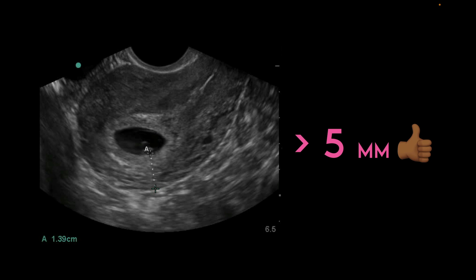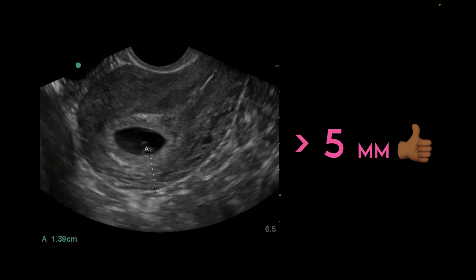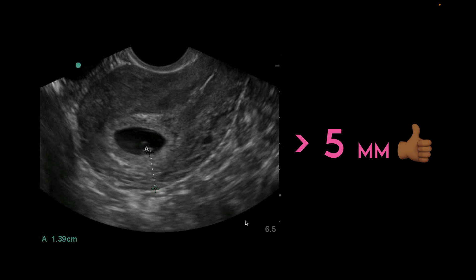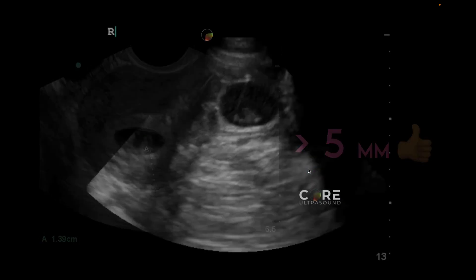To identify a fundal pregnancy that is not in the interstitium or in the myometrium, one of the first things I look for is whether there is a thickness of the myometrial wall completely surrounding that gestational sac of greater than 5 millimeters. If you see that, there's a good chance it is not interstitial or myometrial. You can see here this measurement is 1.39 centimeters, which is well above our 5-millimeter cutoff.